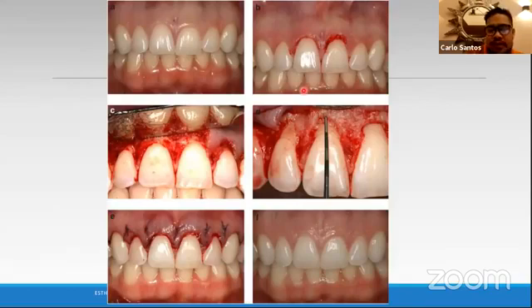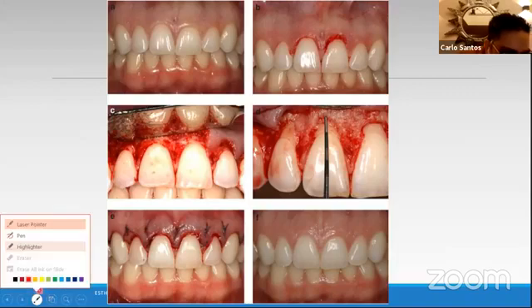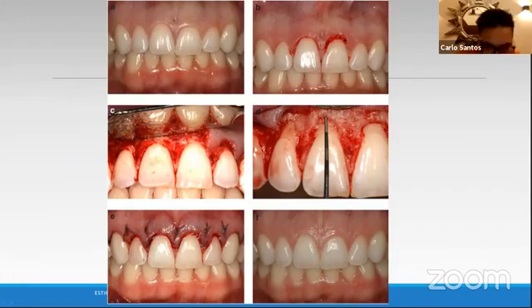The first incision that we do is a 45 degree incision. Given that you've determined your biologic width, you use, for example, your perio gauge, and we incise. It should be 45 degrees. Remember, it should be beveled, not 90 degrees. The angle of the blade should be 45 degrees. Let me stress that out because that's very important, guys. It should be like this, 45 degrees. 90 degrees is like this. So we do 45 degrees. It has to be beveled.